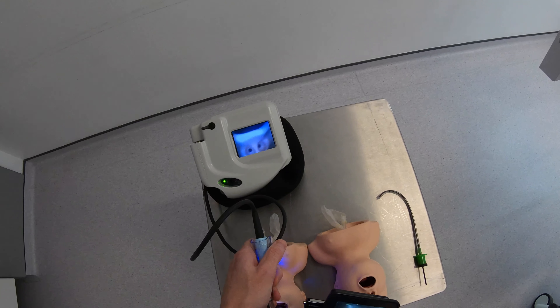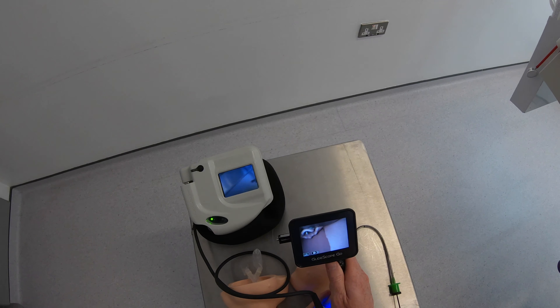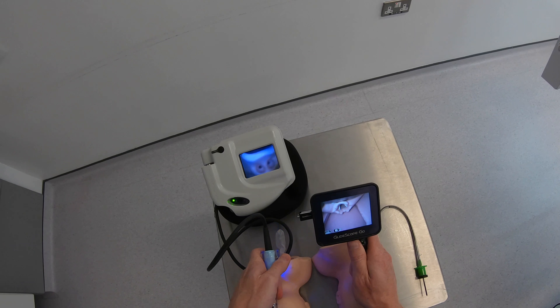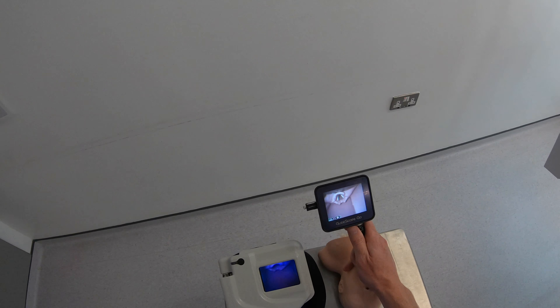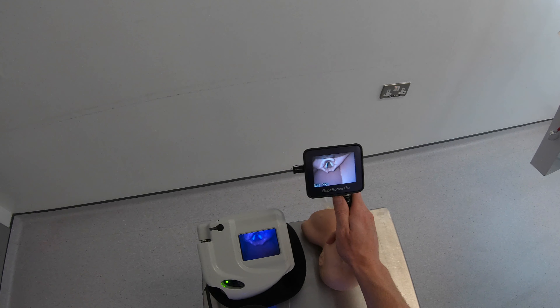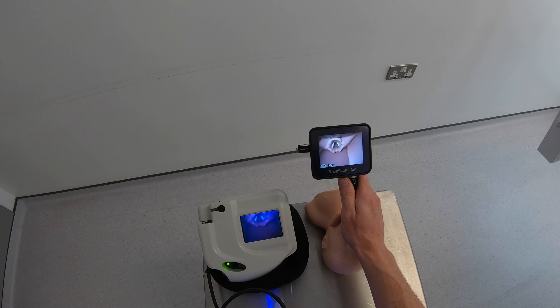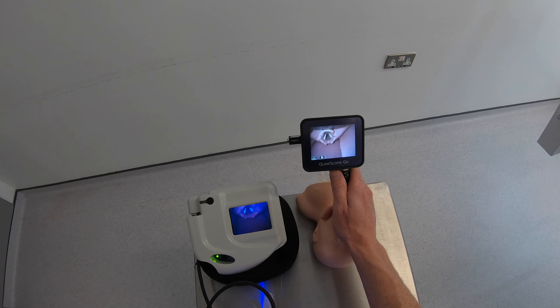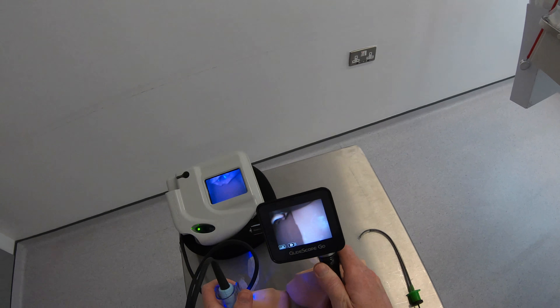Let's have a look and see what sort of view I can get with these — is there any difference? I've got two identical models. I think it's fairly clear there is a significant improvement in image quality. You can see how well defined the tissues are and how well defined the cords are on the new device compared to the old one.